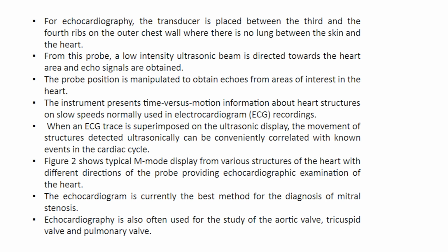The echocardiogram is currently the best method for the diagnosis of mitral stenosis. Echocardiography is also often used for the study of the aortic valve, tricuspid valve and pulmonary valve.